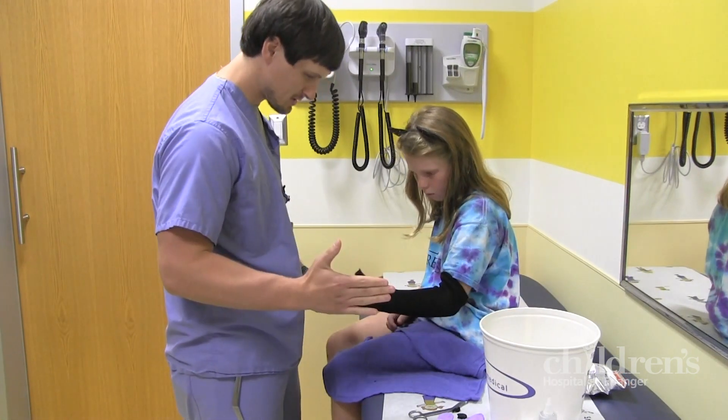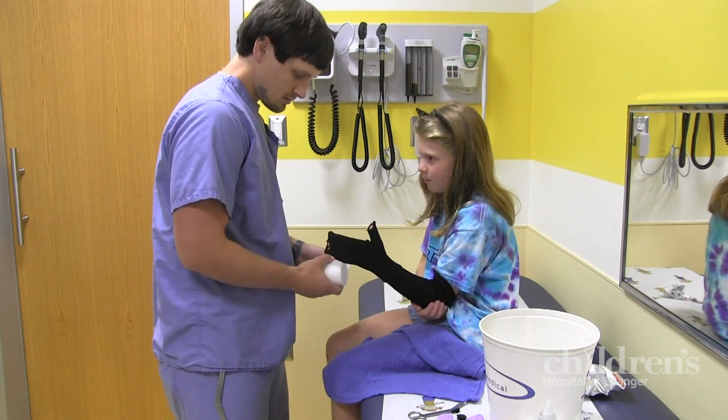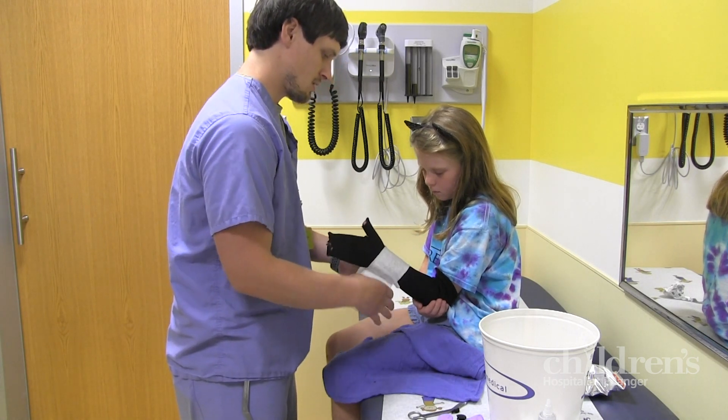Once we've created the sleeve, we'll show you how to hold your injured limb to help build your cast. Next, the technician will wrap your limb in a soft pillow-like material. Sometimes we call this the mummy layer.